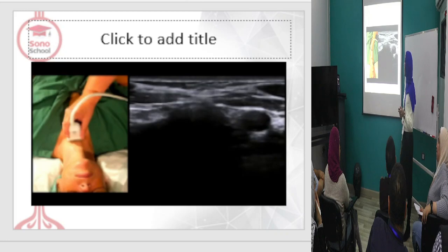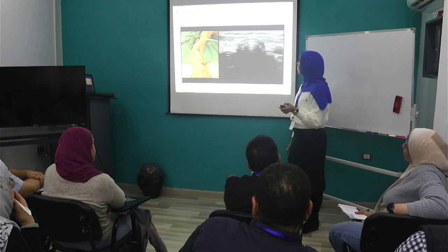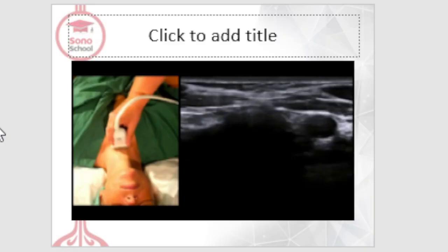Transverse trachea rings, as you're going up.